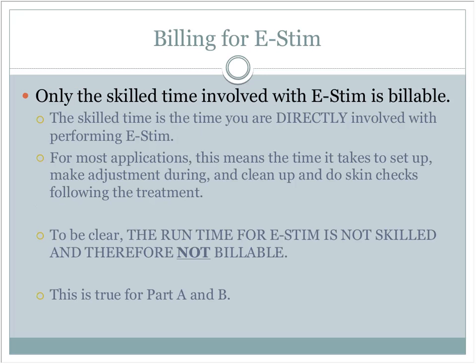eStim gets a little bit more tricky. Basically, we only get paid for the skilled time involved with eStim. So this is the time you are directly involved performing the eStim. A lot of times, that just means the time it takes you to set the patient up, turn the unit on, and make the appropriate adjustments, maybe tweak it a little bit, or turn it up if they're doing a TENS halfway through the treatment or if they feel it fall off and you want to increase it back up again, and then the cleanup and the skin check time.